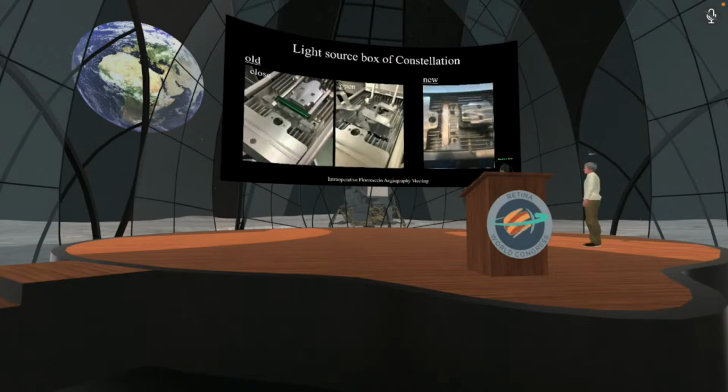Dr. Franklin told me that the older version of the Alcon Constellation can also mount a filter in. If you are considering using this technique, I recommend checking the version of your Constellation. In some cases, it may not be necessary to purchase an external light source. Next, please.